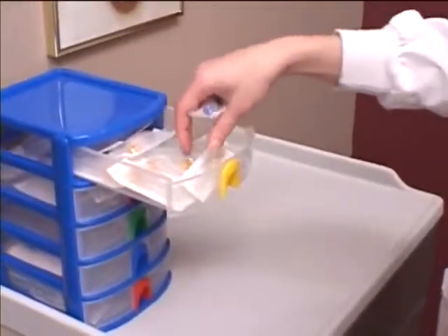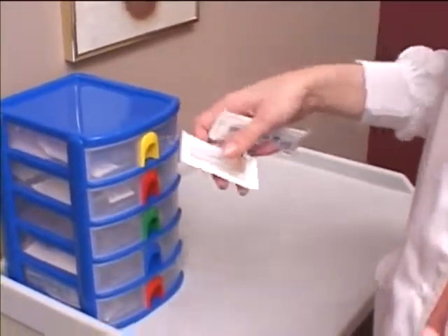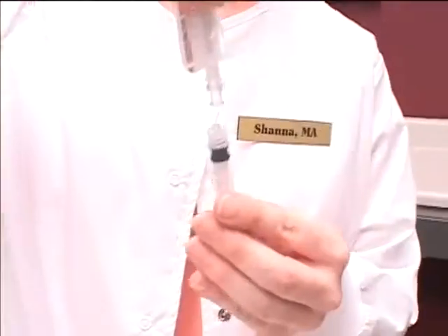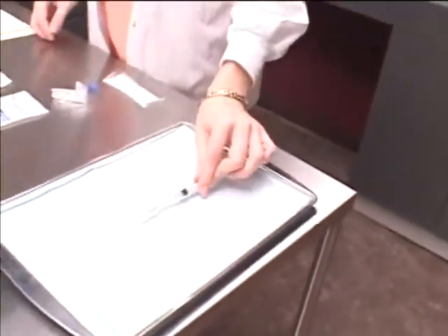Then select a filter needle that will trap any glass fragments when withdrawing the medication from the glass ampule. Put aside a sterile gauze pad to use to prevent you from being cut on the jagged edge of the broken ampule. Open the syringe and attach the filter needle. Place it down on a clean surface.